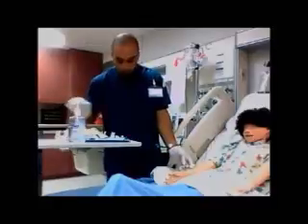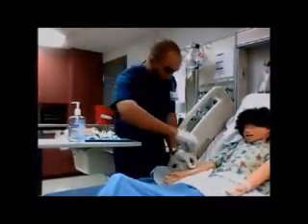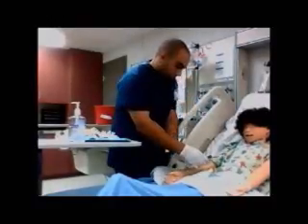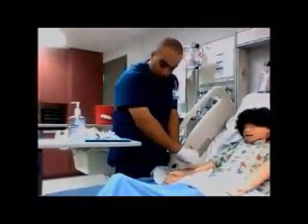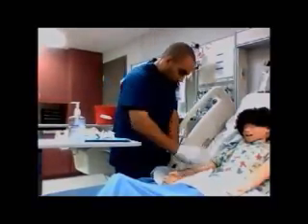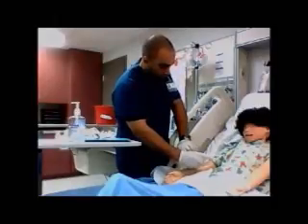The RN then takes his pre-filled medication syringe and directly attaches the medication syringe into the saline lock. He pushes the medication at an identified rate, cleanses the port, and attaches another saline flush to the catheter, pushing it at the same rate as he pushed the prior medication.